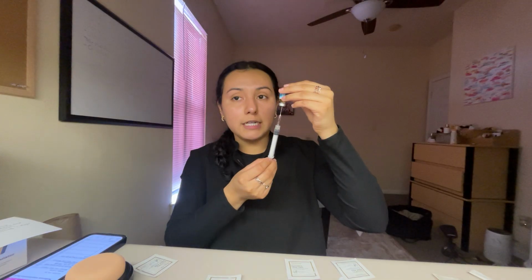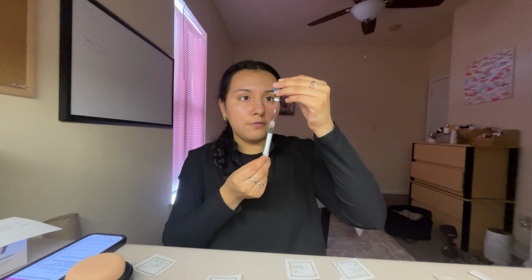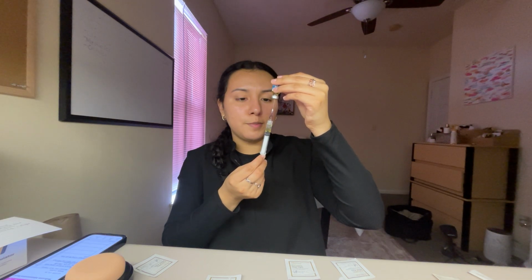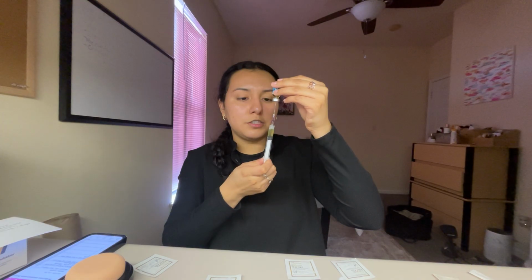But since we're dealing with narcotics, I'm going to allow all of the solution to be removed from the vial. We can either let the air pressure fill it, or we can go back and forth with a syringe.